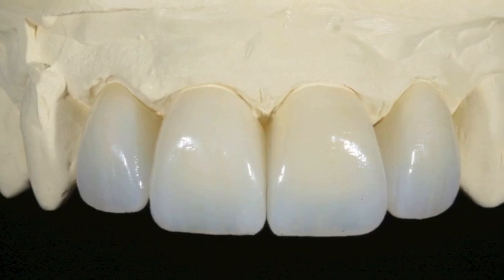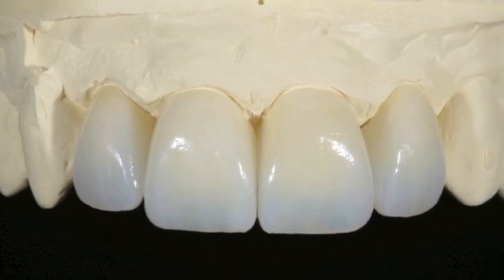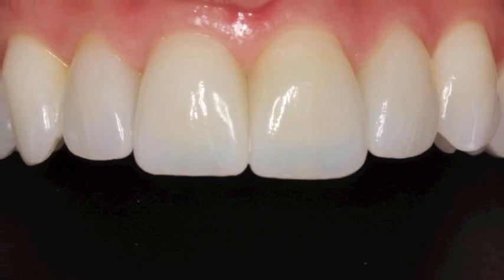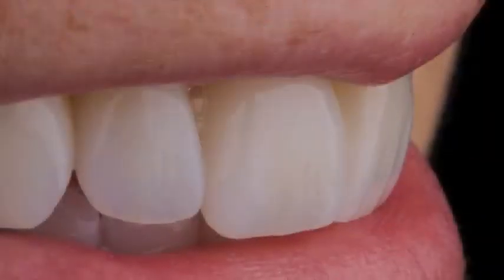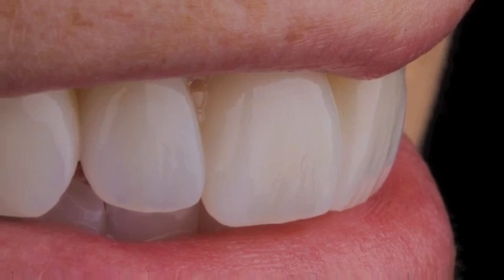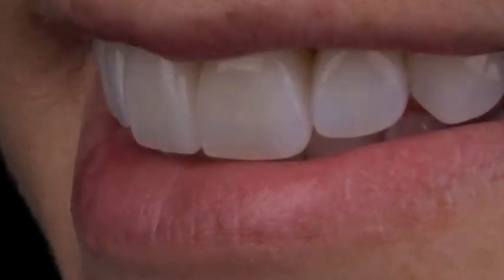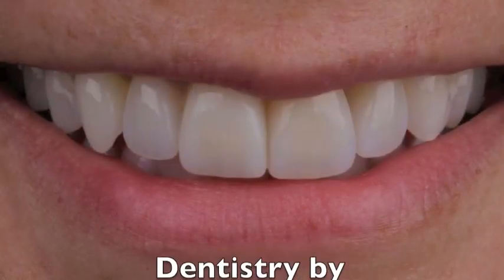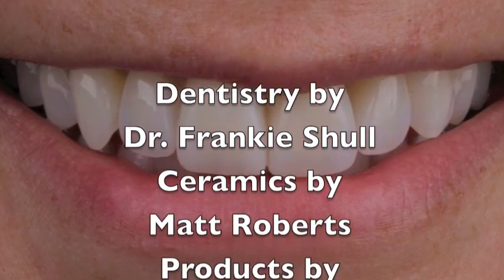And again on our solid model, again note the embrasure form in between the teeth and how that transfers to the mouth. Here we've matched the optical qualities of the natural tooth enamel fairly well without doing any layering at all, simply by picking the correct ingot. Again, in this case, this was an opal 1 in a fairly thick restoration.